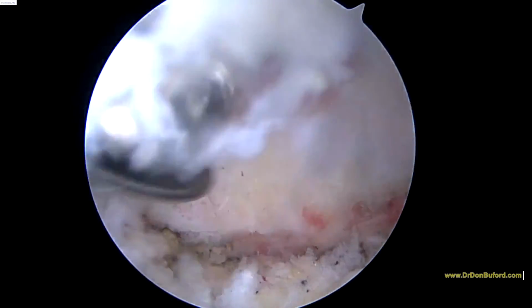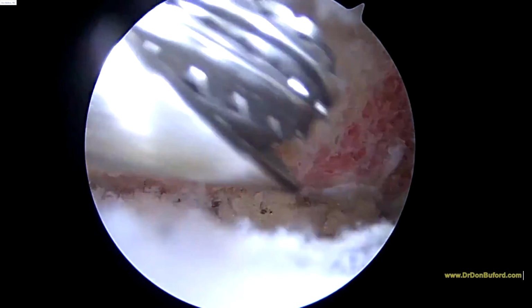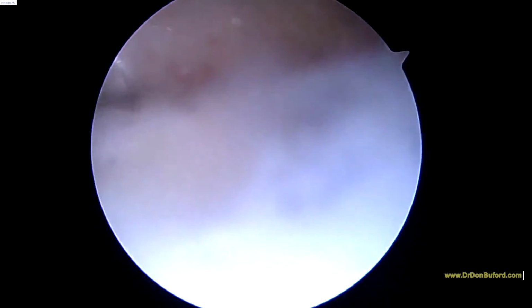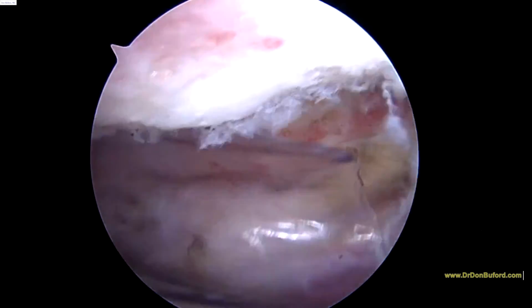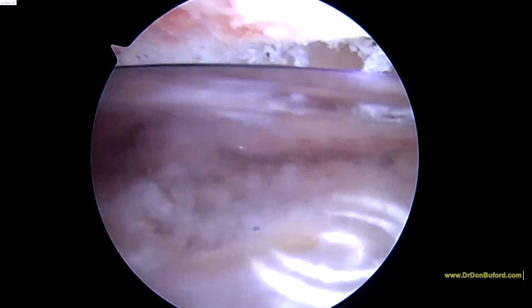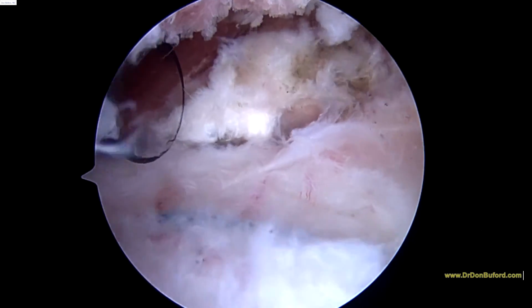So we're going to finish up here and get you back to the recovery room. But actually, before we do that, we've got to tie one more suture. Hold it, Karen, please. We've got to tie the sutures for the biceps tendon. So we'll pull back with our scope. And the left, so we're going to use a crochet hook so we can retrieve them and show you some more in a minute. Okay, we're just finishing tying the suture here.